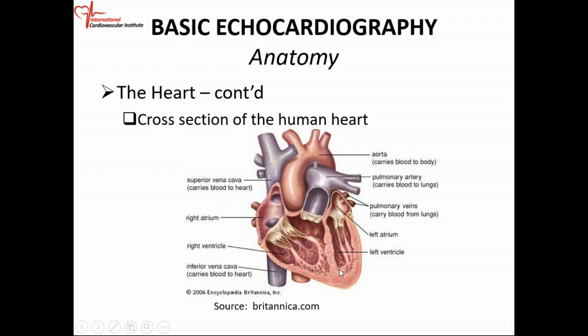So this is the left ventricle. This is your ventricular septum. This is your right ventricle. You can see this little hump right here. This is papillary muscle. And then attached to these little humps, you have these little cord-like structures. This is what we call the chordae tendineae. Okay? Cord-like structures that attach to the papillary muscles, we call them chordae tendineae.